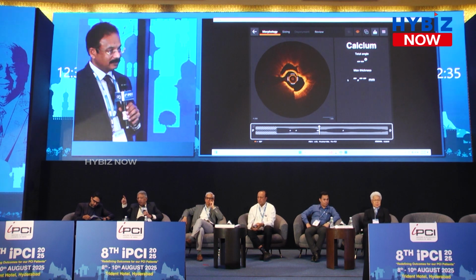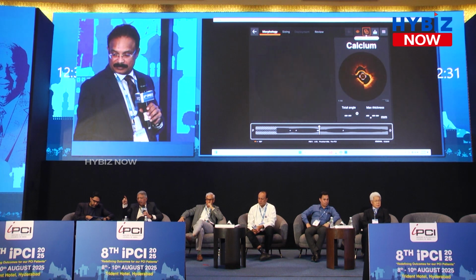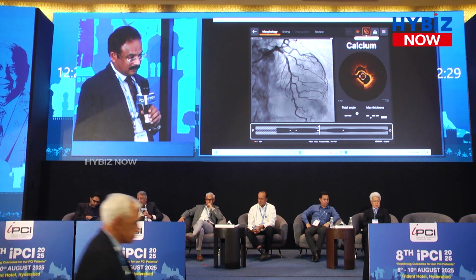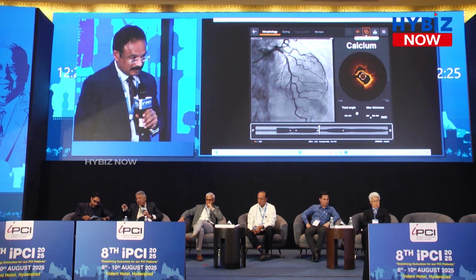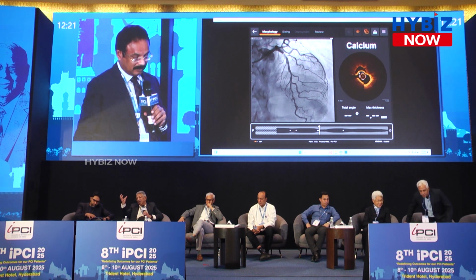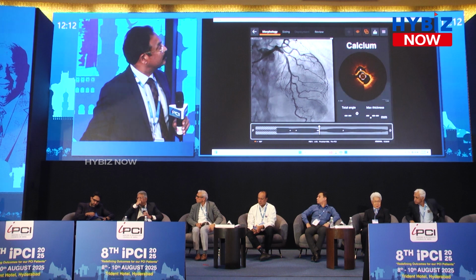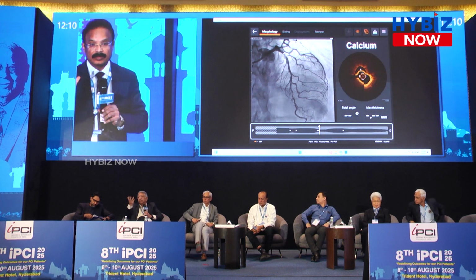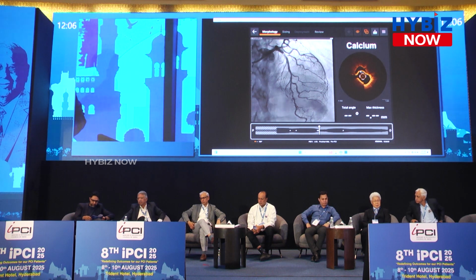So you can see also at which part of the coronary artery you are on. Great. So you're at that part. See, that's where the lesion is. And now you see very clearly that you've got an intima that's torn off, and below the intima you most probably have got a nice cavity. So this is an acute coronary syndrome with either a ruptured plaque, and that's healed. One thing is we may not require any aggressive lesion preparation. The fibrotic component is much less. It's mostly lipid rich, and there is not much thrombus, so a slow flow chance is less likely.